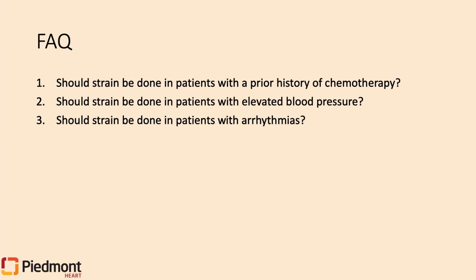And if you have a patient with a lot of PVCs, try to wait till those PVCs quiet down and you can get 3 beats in a row without PVCs to get your strain. With AFib, if you can find an area in AFib where the R interval is consistent, use that. But again, if the rhythm is just not letting you track strain or get your bullseye, then just show that the attempt was made, and we will understand that.